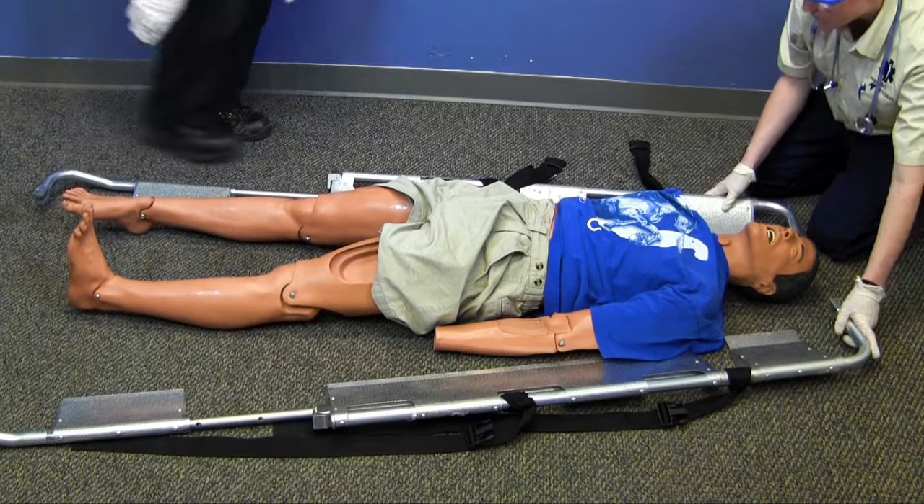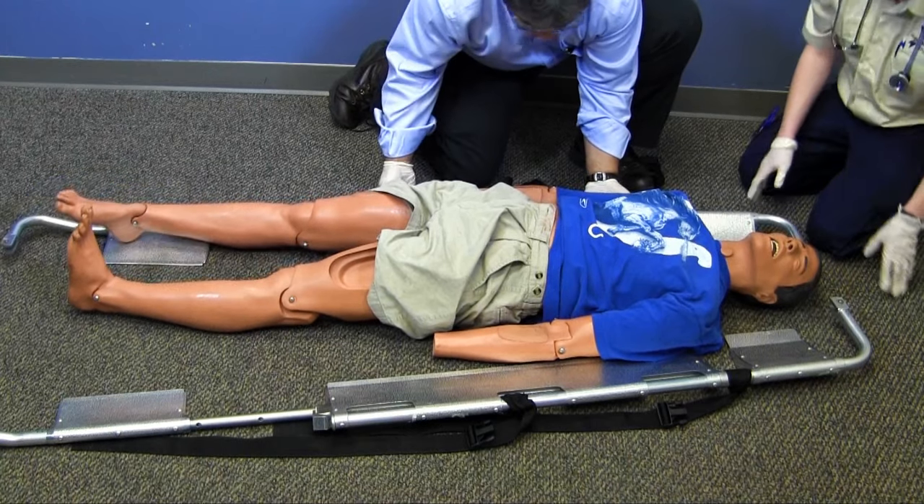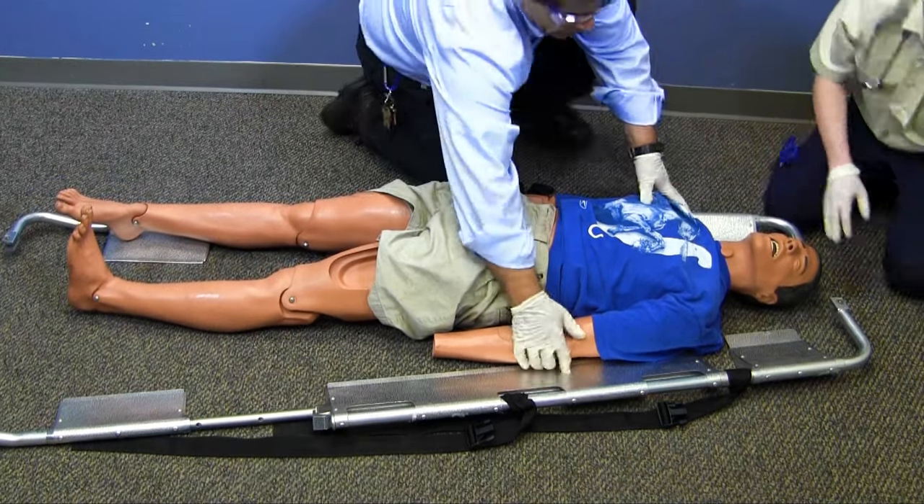I will place one side of the scoop stretcher under the patient. If I need to, I can log roll the patient slightly to facilitate positioning of the stretcher.